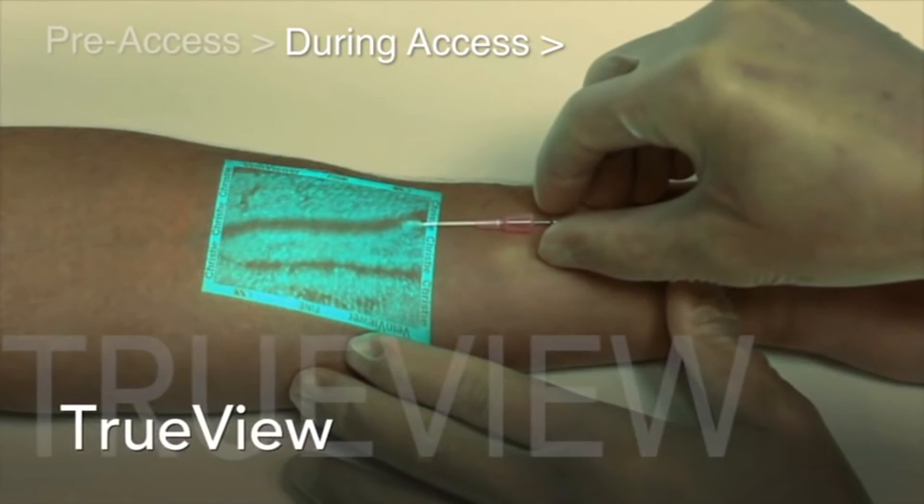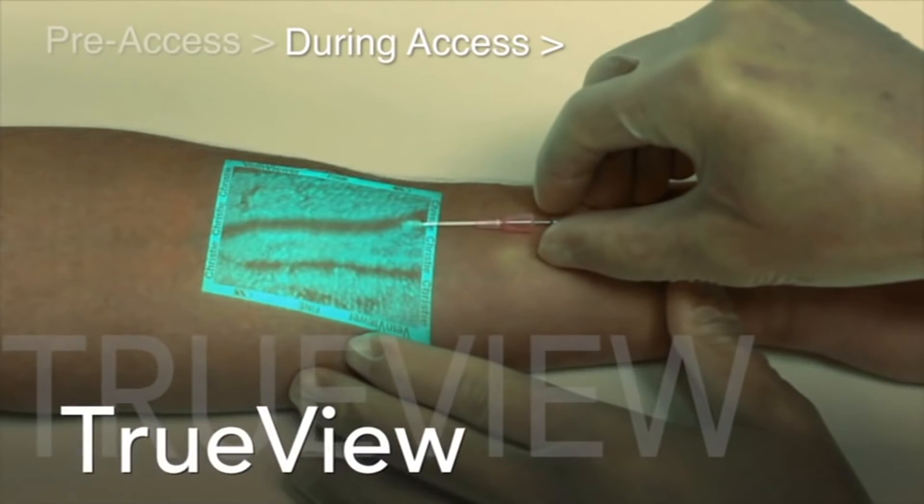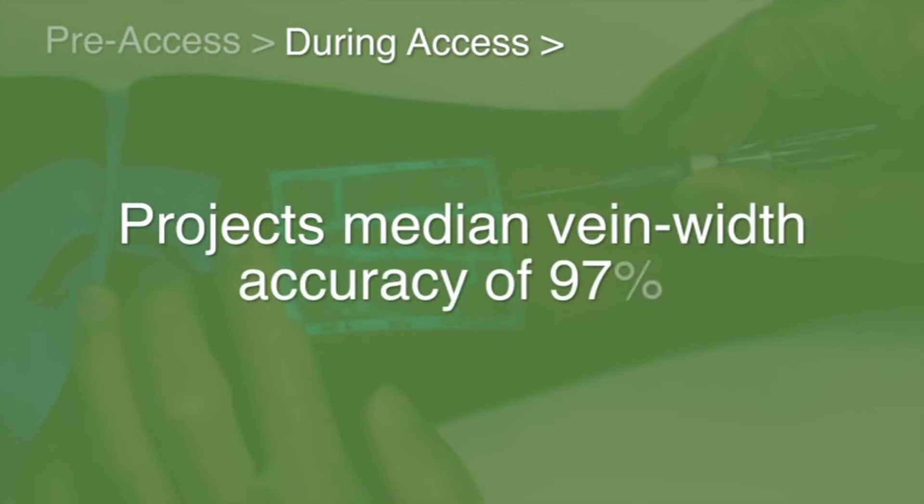During access, only VeinViewer's TrueView technology projects a median vein width accuracy of 97%, delivering an image you can trust to help you choose the most appropriate catheter size for improved dwell times.